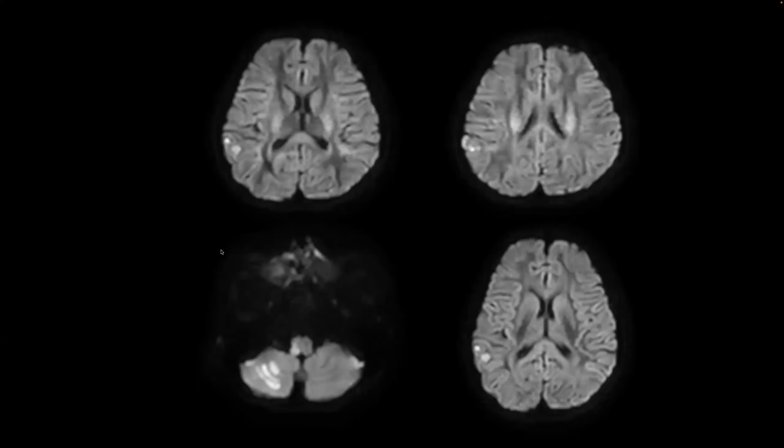The vertebral artery is more likely a thrombus, but yeah, just these small changes over here. Again, they are very peripheral to be picked up on an angio, I guess.